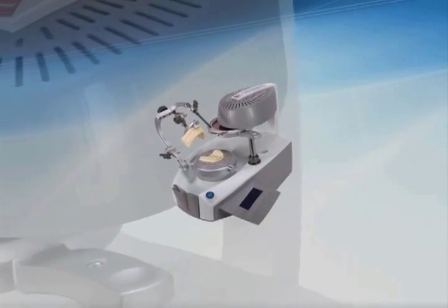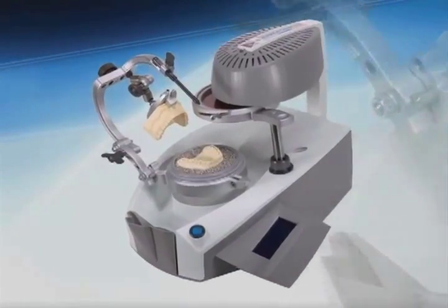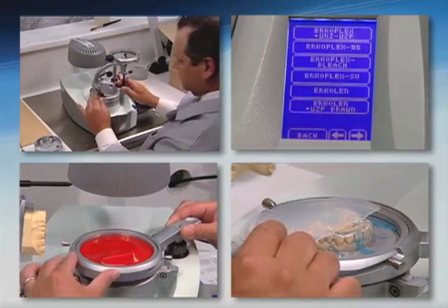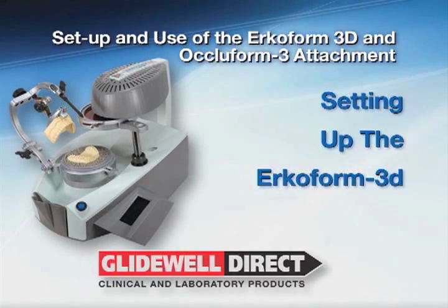Thank you for purchasing the Erkoform 3D, the most precise and versatile thermoforming system available today. This video will cover the setup and the use of the Erkoform 3D and Occluform-3 unit.